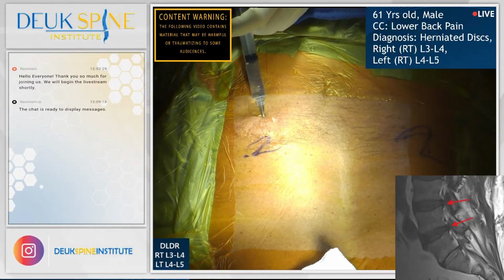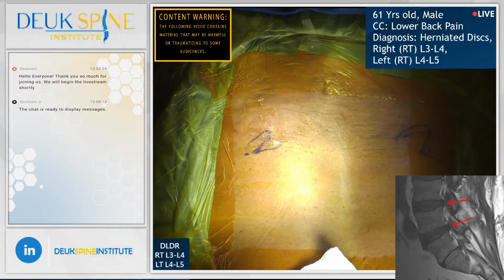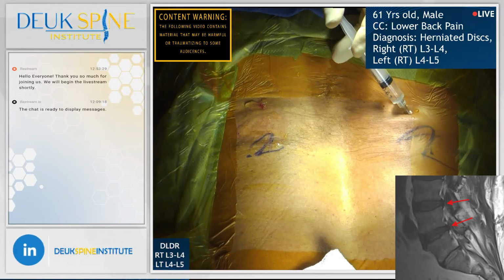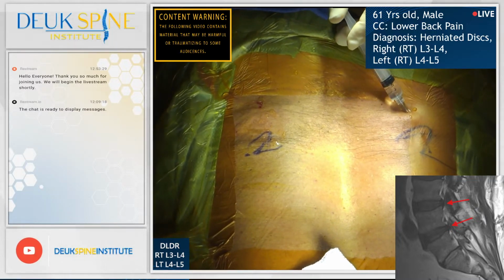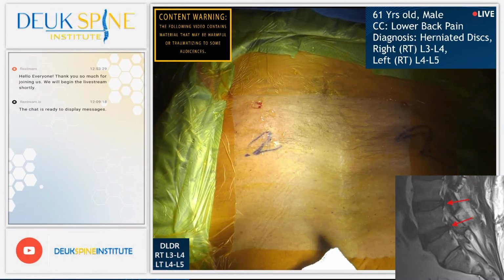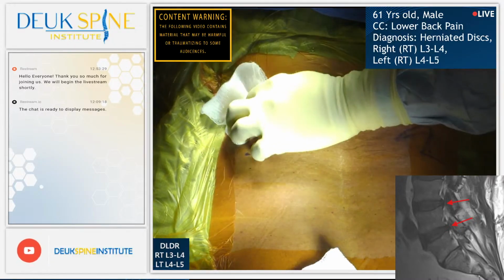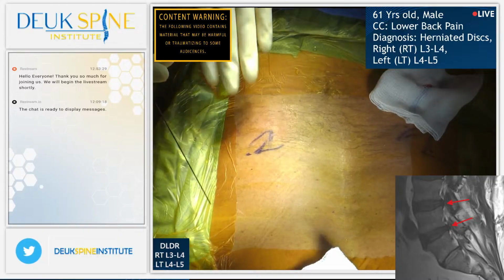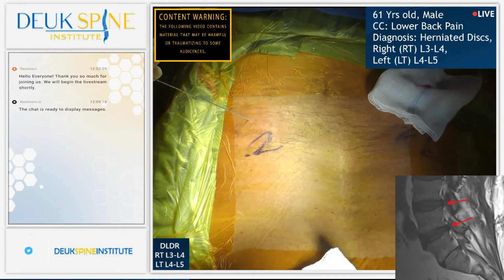Feel free, folks, those of you that are watching, to ask questions, and I'll be happy to answer them for you. In the meantime, while we get started placing our needles, which is the first step here, why don't you tell us or show us a video on the 30 different causes of back pain.